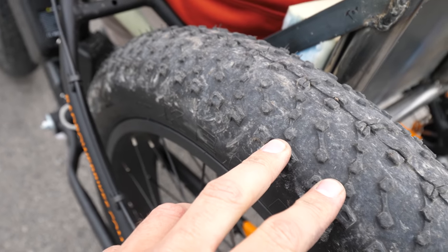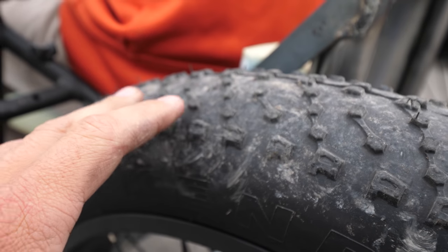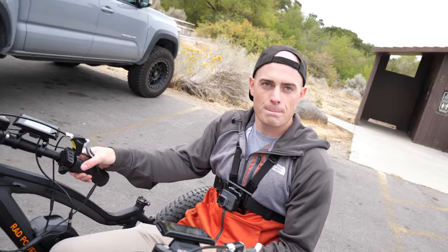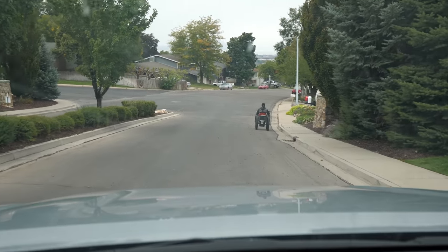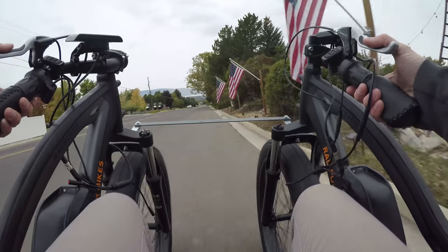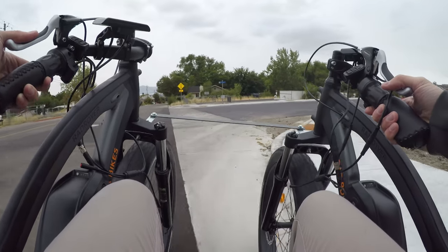We've been getting a little mud on the tires. These don't have a whole lot of traction compared to off-road tires or off-road mountain bikes. Now we're just going to put some miles on it. These bikes are street legal because they go less than 20 miles an hour, and having two bikes in tandem should still be street legal — we'll see.